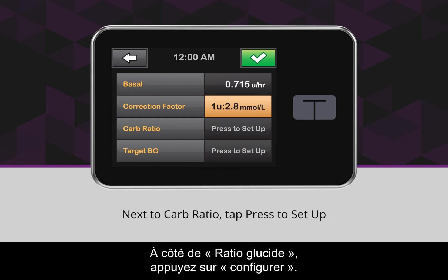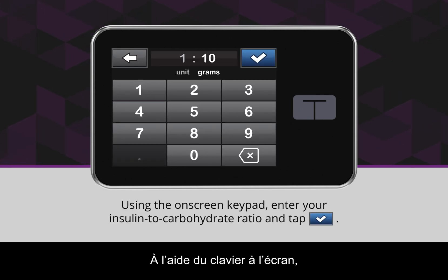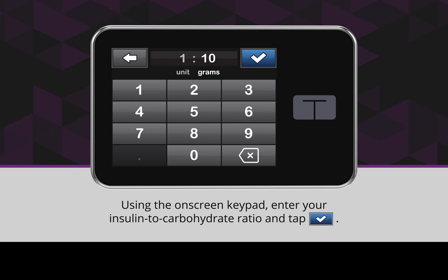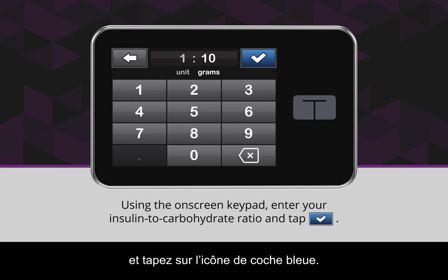Next to Carb Ratio, tap Press to Set Up. Using the on-screen keypad, enter your insulin to carbohydrate ratio and tap the blue checkmark icon.